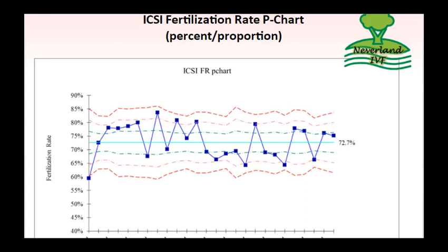There are many different ways to monitor how well an IVF lab is performing. One method, the P-Chart, the P stands for percent or proportion, is a statistically validated method which is often used in healthcare settings. It is specifically designed to graph data represented by a percentage or rate. This applies to much of the data gathered in an IVF lab, such as fertilization rate and pregnancy rate.